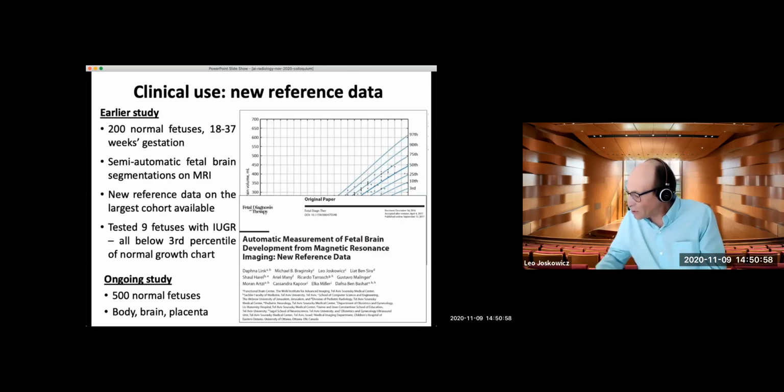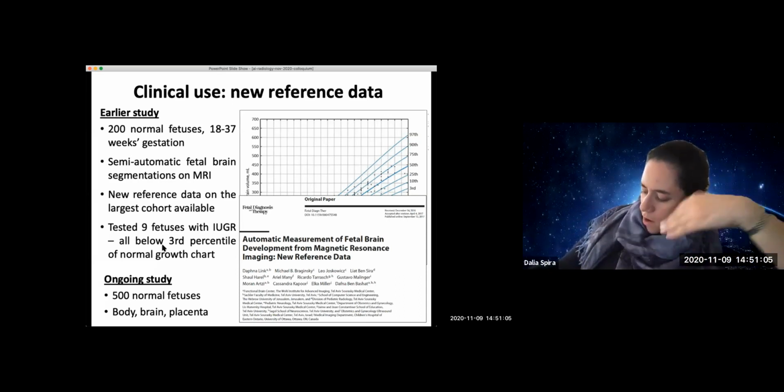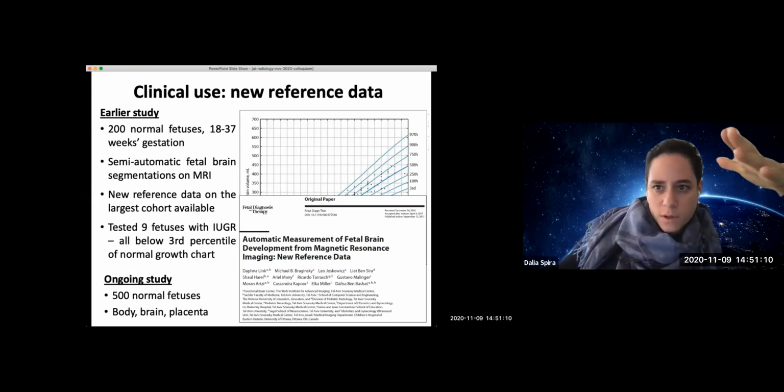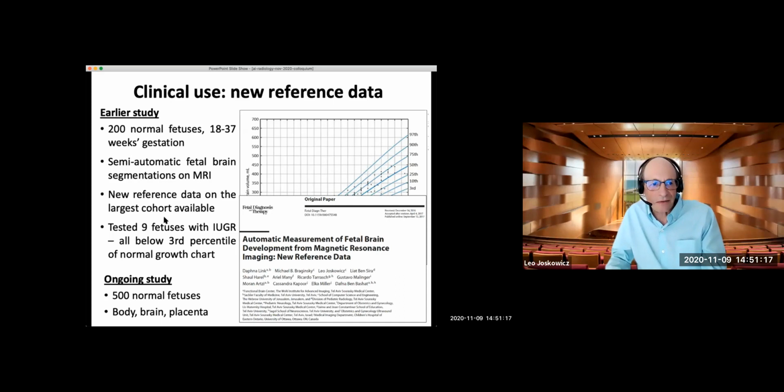Any questions up to now? Yes. Are there any certain rare pathologies that simply don't have enough data to be able to build something like this? Like you just don't have enough scans? Yeah, if you don't have enough scans and it's very rare, then you might not. Every pathology and structure requires a different number of scans, and you don't know ahead of time how many of those you're going to require. With this methodology, you can discover on the go what's missing.